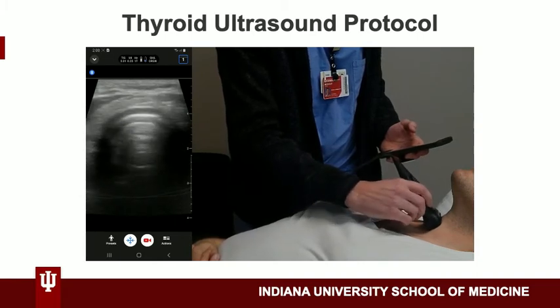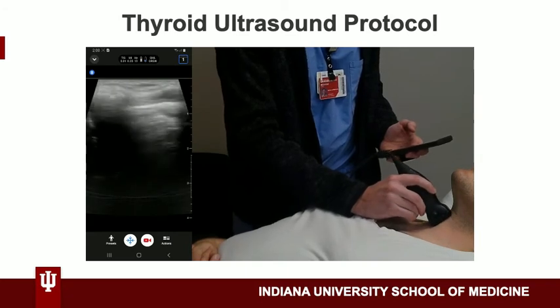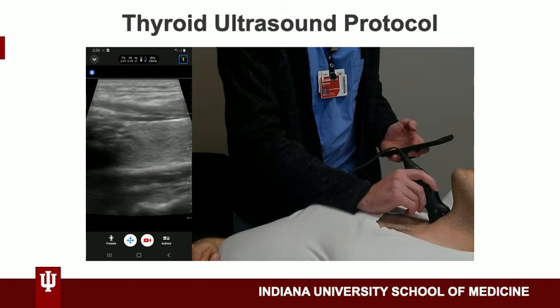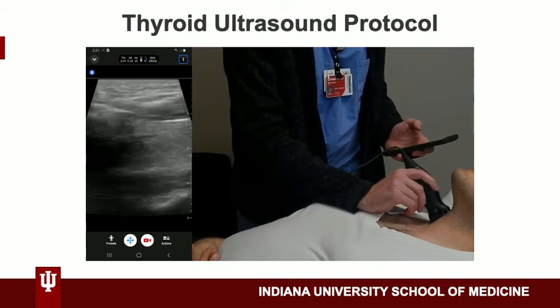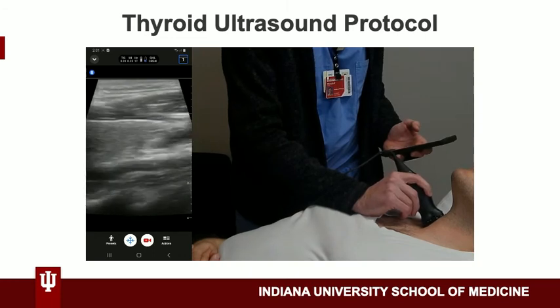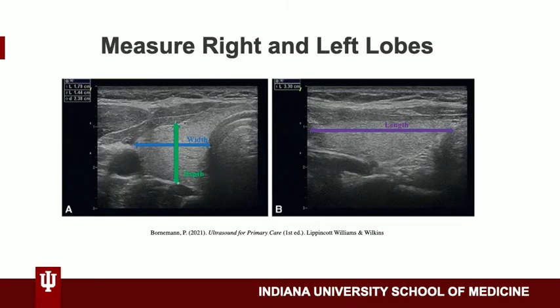After that, get a long axis view of the right lobe of the thyroid. When finished with the right lobe and the isthmus, do the same thing on the left side. When getting measurements of each lobe you will want to measure the width and depth in transverse, and length in long axis. You will also want to measure the isthmus in transverse.